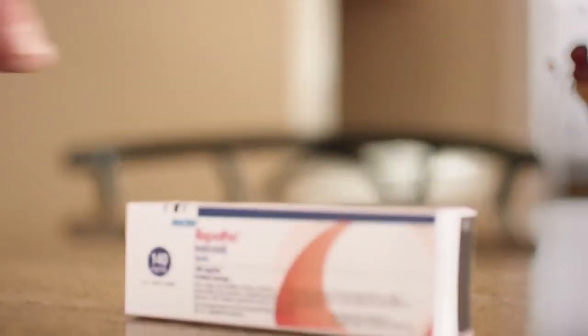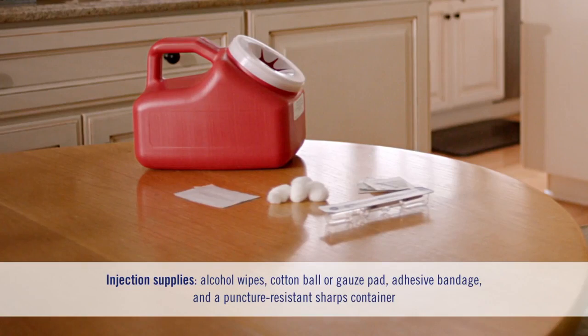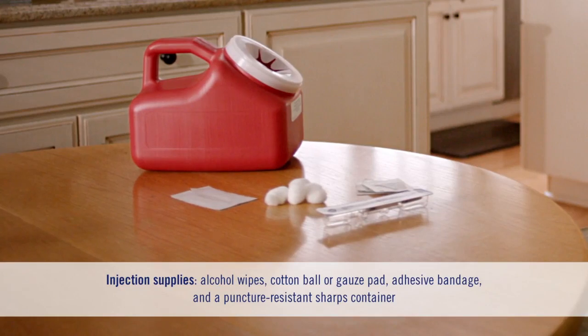After the 30 minutes are up, it's time to get ready for your injection. Make sure you've washed your hands. Next, choose a comfortable spot with plenty of light. Gather all of your injection supplies and place them on a clean, flat work surface.